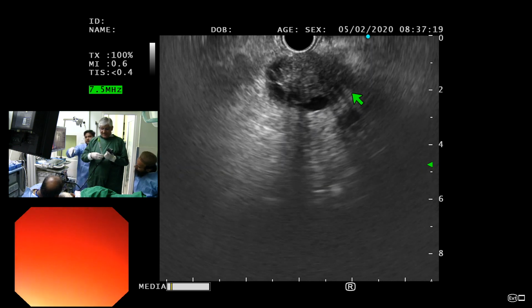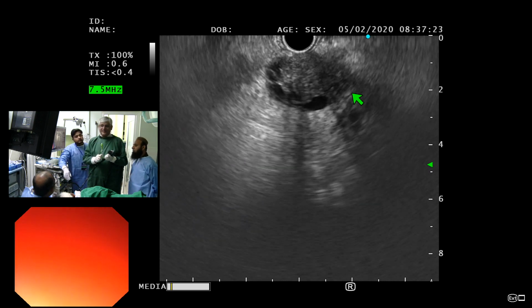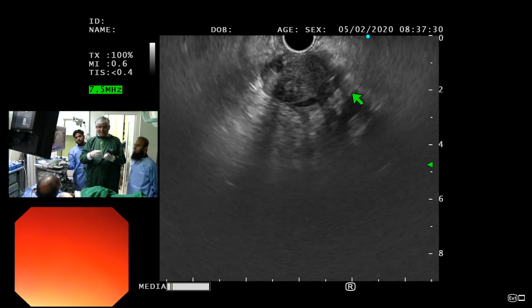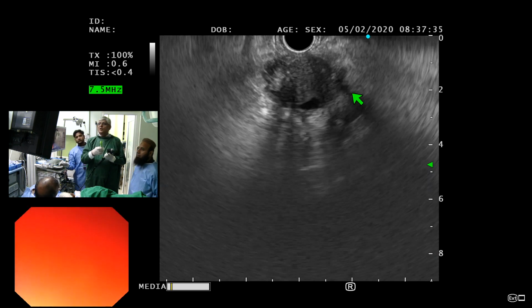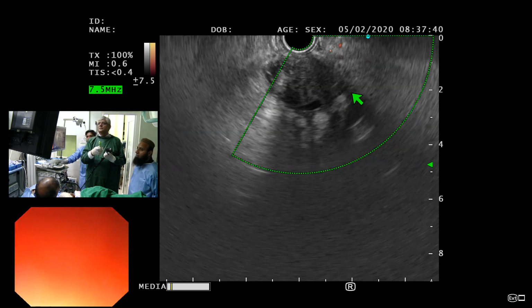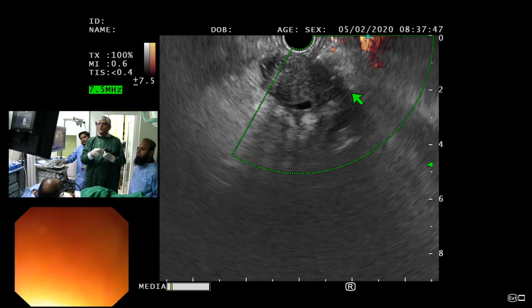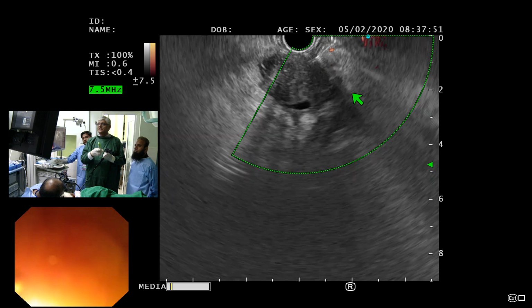The threshold that we have, I like it here. So everything is good. What I was telling you is that I took this off. If you want to, you can lock things. Put the flow down. Okay, so we are good. Needle's coming out, we are fine, right? And there is no tightness that I feel. I've got it at almost a 90 angle. Take the flow off, please.